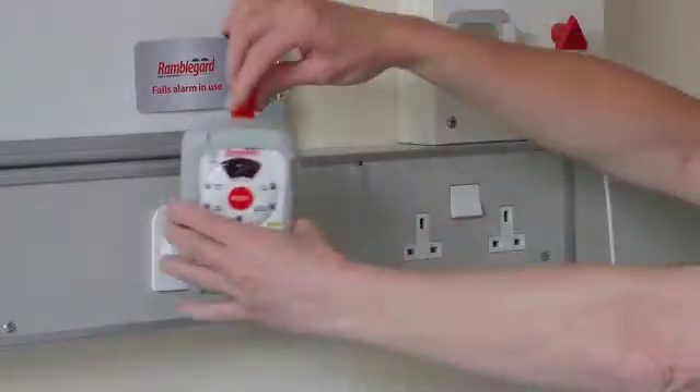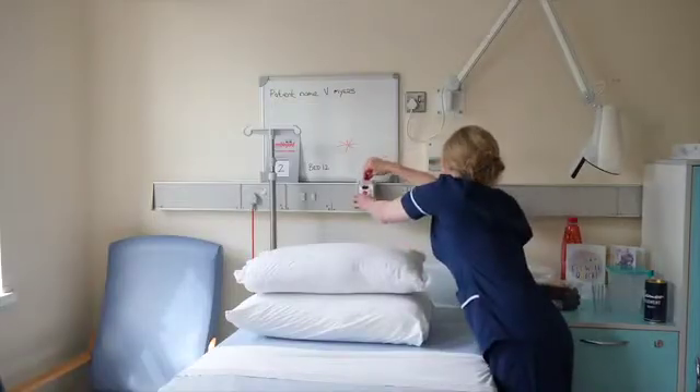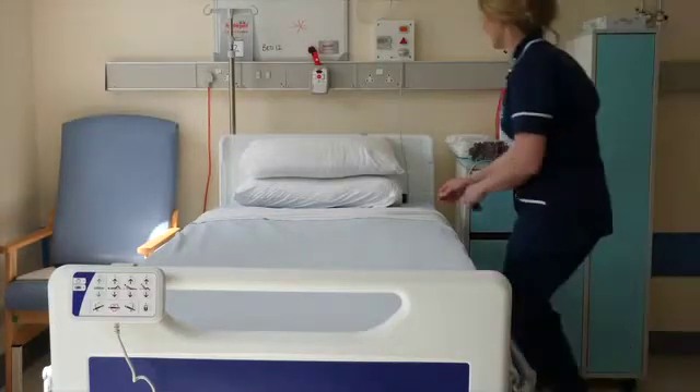Finally, place the companion at a desired location. A recommended location is at the head or foot of the bed, as shown. Your patient set is now ready for its initial test before use. To test the system, apply pressure to the sensor pad as shown.